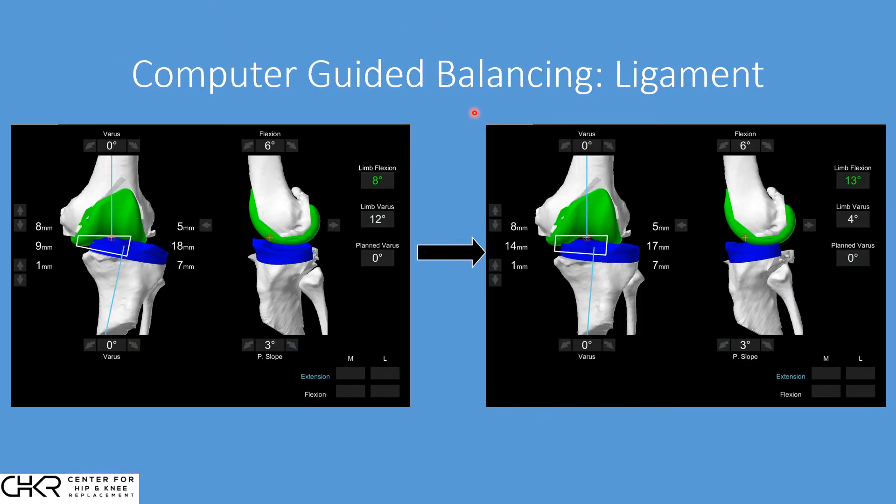After anatomic alignment and placement, we move into computer-guided balancing, which has two separate stages: ligament balancing and fine-tuning. In ligament balancing, we start with our original deformity — that's the bow-leggedness of 12 degrees — and we can see how far off this is from neutral. We apply gentle tension to the optimal length of the collateral ligaments and the surrounding capsule. From this, we can already correct eight of the 12 degrees of deformity, and we know quantitatively how much we're correcting.